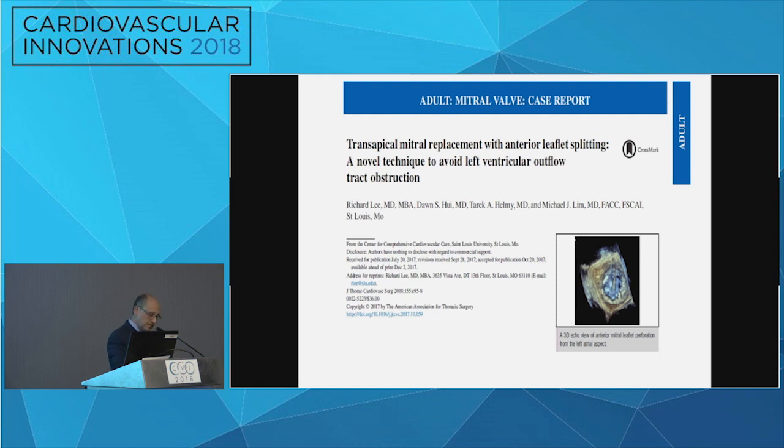And there is the question of how much perivalvular leak you are going to have because of that. Hypothetically, you're slicing the leaflet in a different spot, so you're touching the annulus with no leaflet. The idea that people have thought about when you put a valve in MAC is creating a rim of leaflets that can potentially decrease your perivalvular leak. I agree with you, and this is one of the points that we made: you puncture in the middle of the A2, so you have a little bit of a rim.